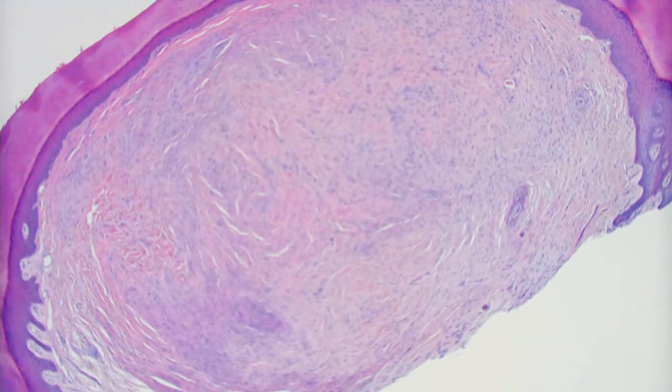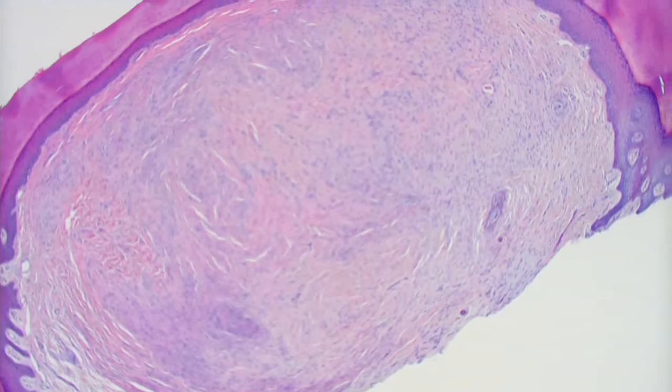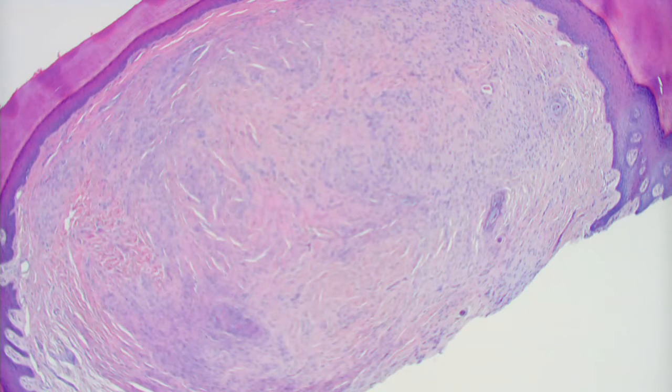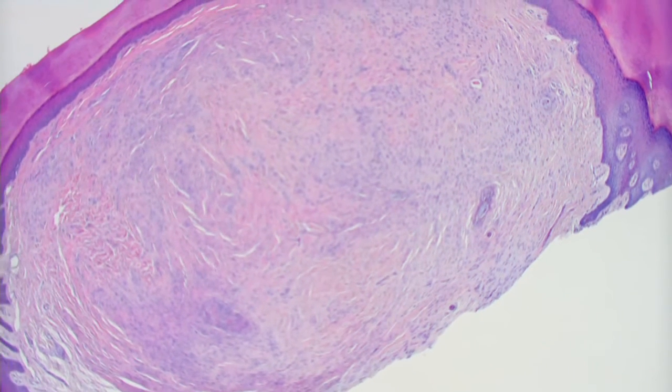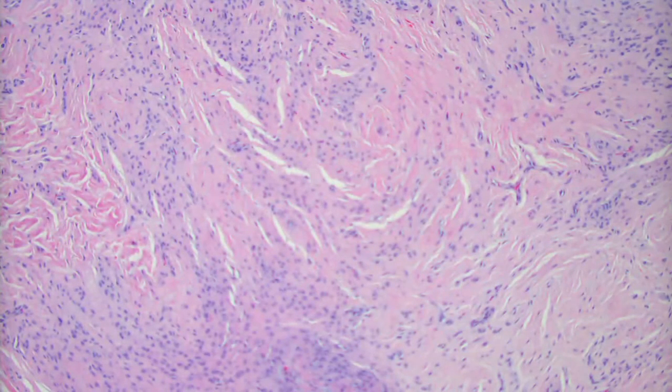Sclerosing perineurioma. I don't get that part. Well, what's in the differential diagnosis of this? I went down my acral bumps differential. I wrote down acral fibromyxoma, but it wasn't obviously myxoid enough. Good, excellent. And then I was thinking bumps on the hand or bumps on the foot, like the glomus, but that didn't fit.